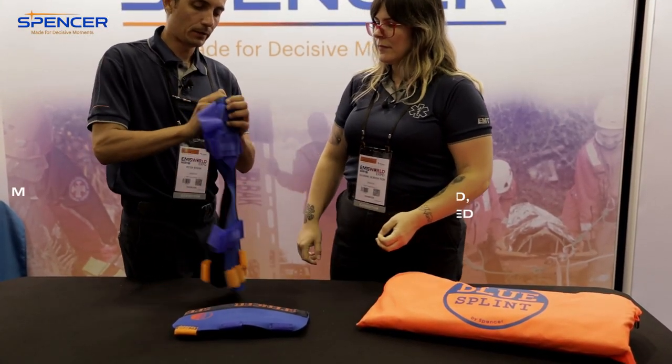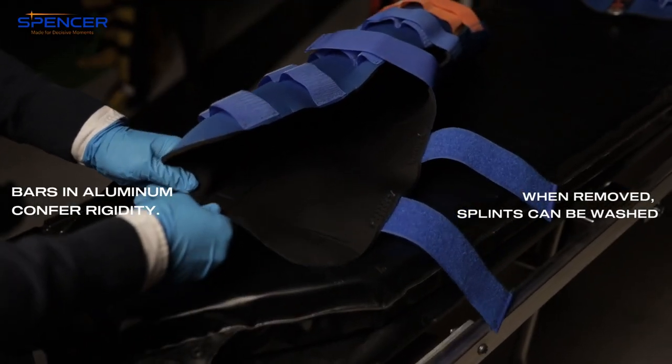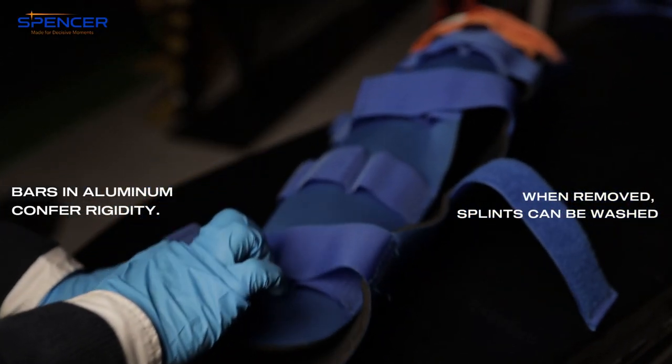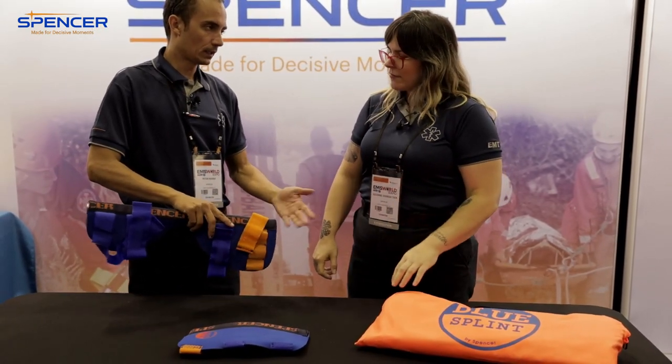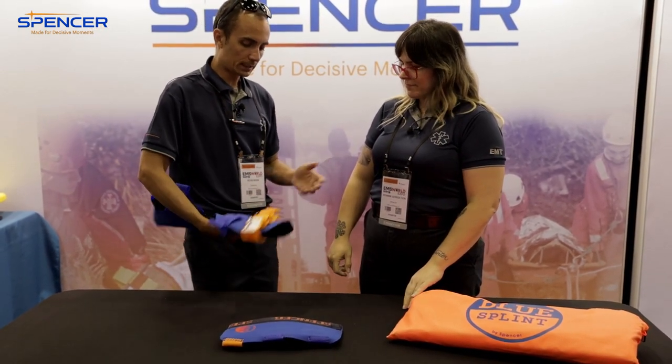So if you get it dirty, you just pop out the bar, and you can wash the cover in the wash. That's nice. Spencer puts the orange at the top, so you know the orientation.